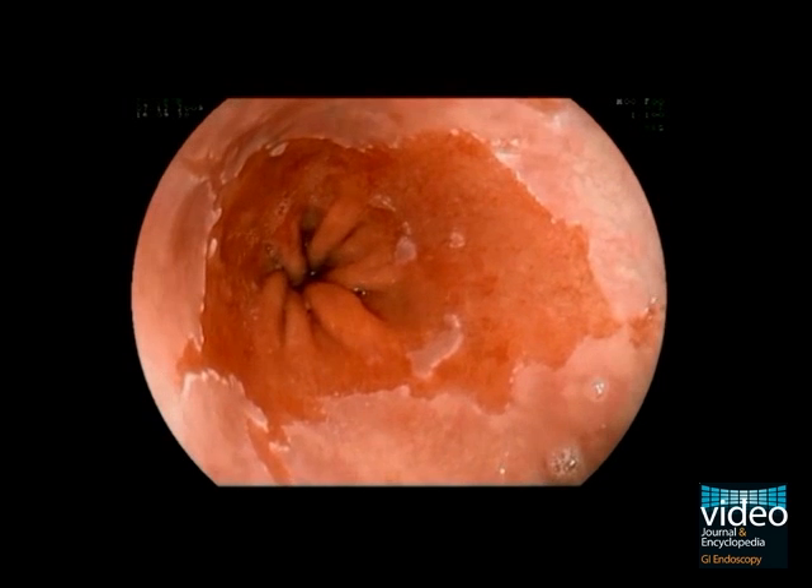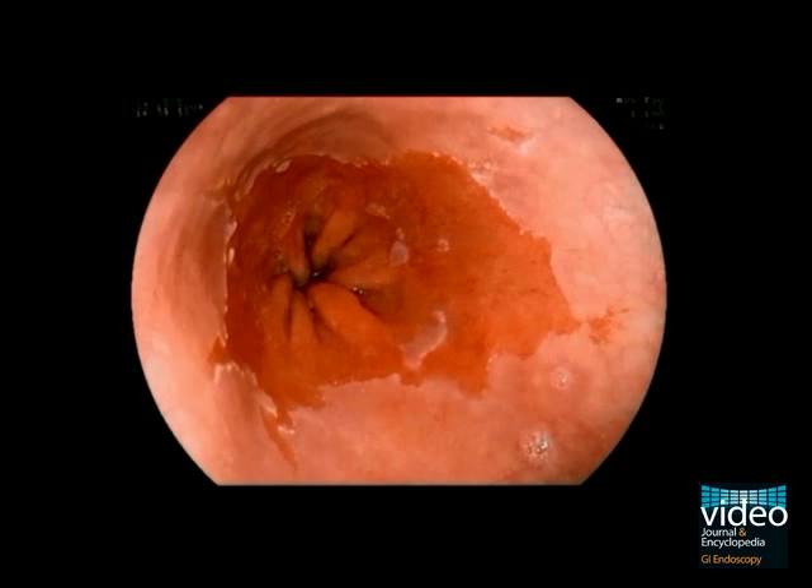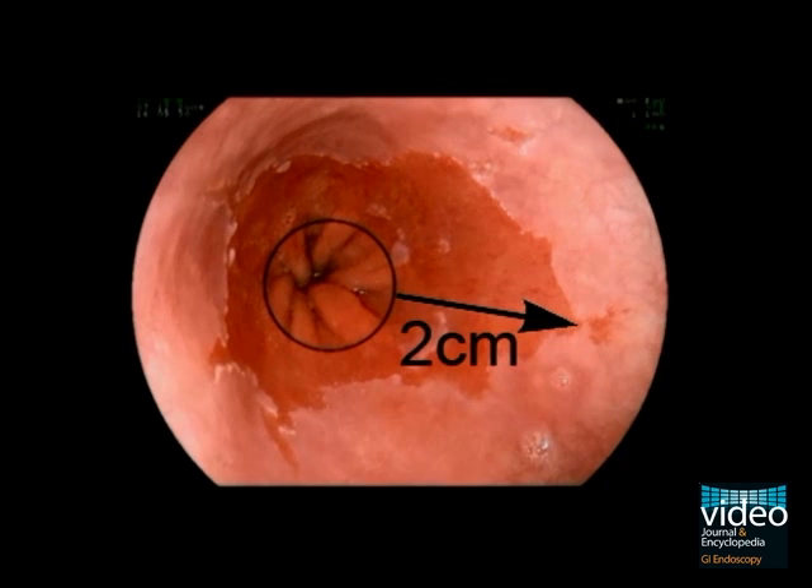Now we repeat the measurement from the gastric fold to the proximal end of the Barrett's epithelium — it measures two centimeters. According to the Prague classification, this distance in centimeters constitutes the M-value that denotes the maximal length of the Barrett's segment. All in all, this Barrett's segment is classified as a C1-M2 Barrett's esophagus.